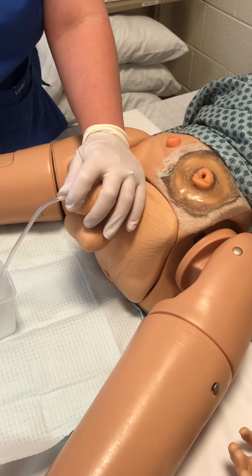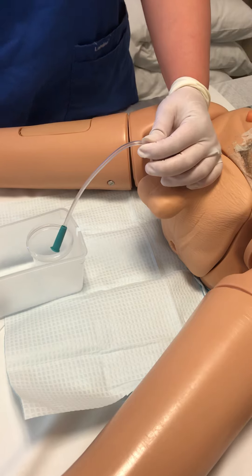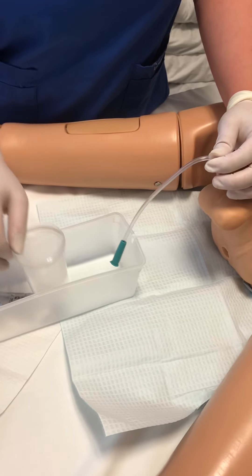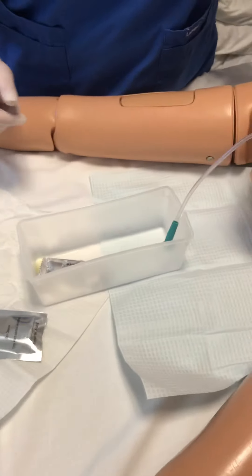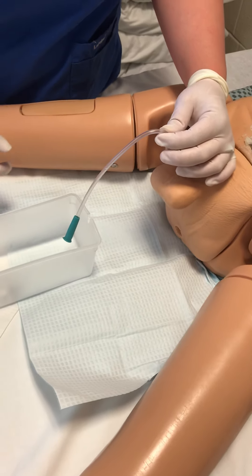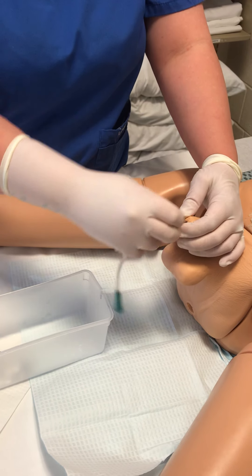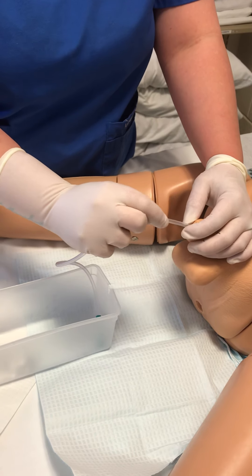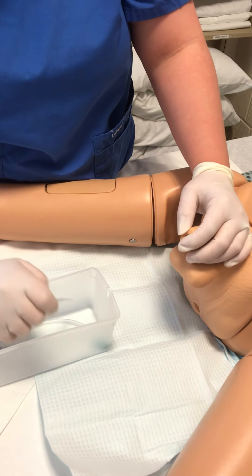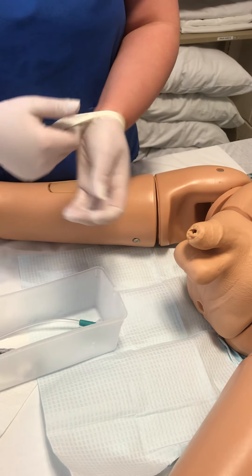Now I'm going to hold it right here. I'm going to fill my sample cup with urine, and then go ahead and move it out of the way over here and let the patient finish voiding. Once he's done, I'll tell him he's going to feel some more pressure, and then I will pull the catheter out. I would fold my gloves up and take them off along with the catheter.